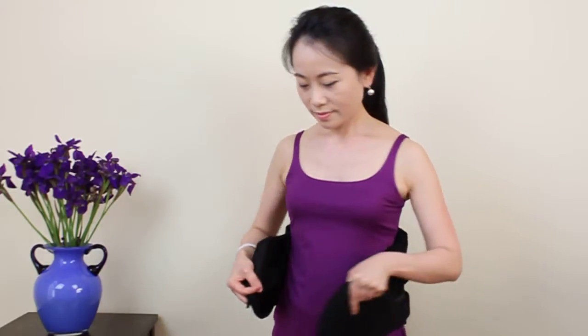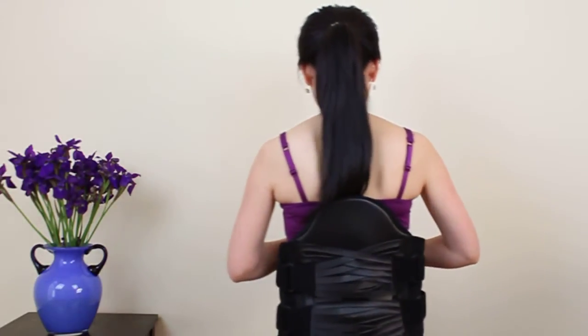While in a standing position, place the compression orthosis so that the posterior plastic plate is centered in the lower back region.